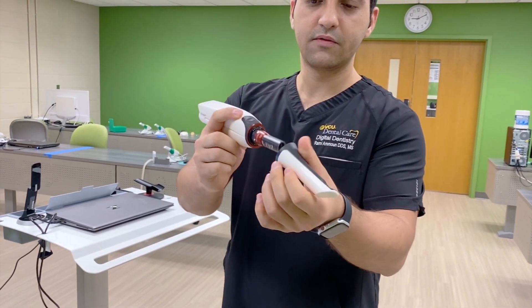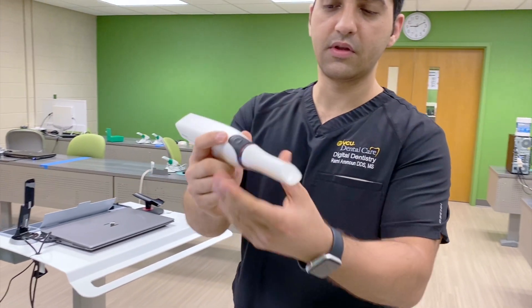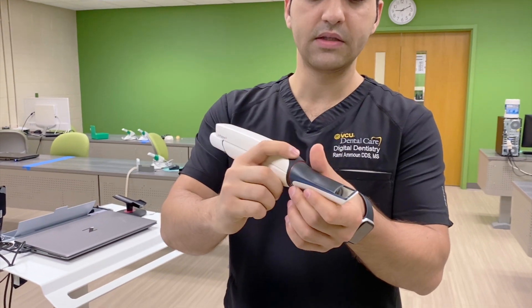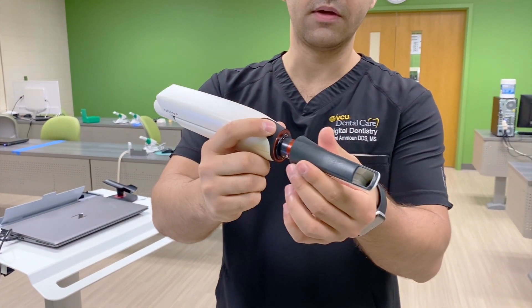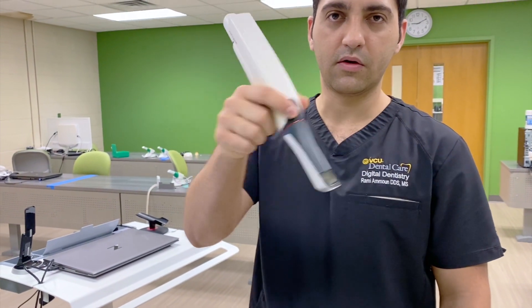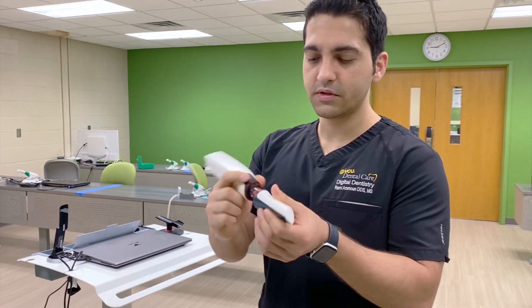Now there are two positions of the tip. One position is when you're doing the mandible — you're going to be holding it like this. For the maxilla, you're going to flip the tip like that and you're going to be scanning the maxilla, or the upper. This is for the Trios 4.